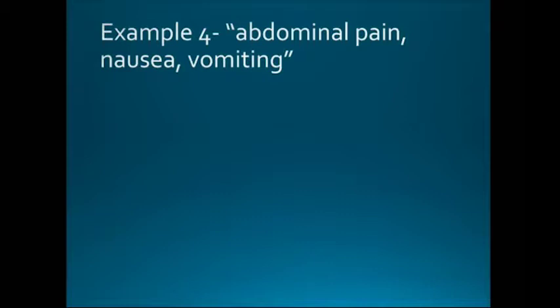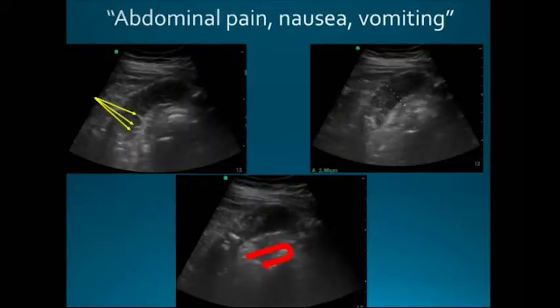And the CT scan was read as no acute obstruction, ileus. She really wasn't doing well. Belly was more distended, she was just vomiting a whole lot. And when I saw her, she had dilated, fluid-filled loops of bowel. So this is an example of a loop of bowel here. You can see the little plicae circularis kind of coming in here. And you can see that it's dilated.